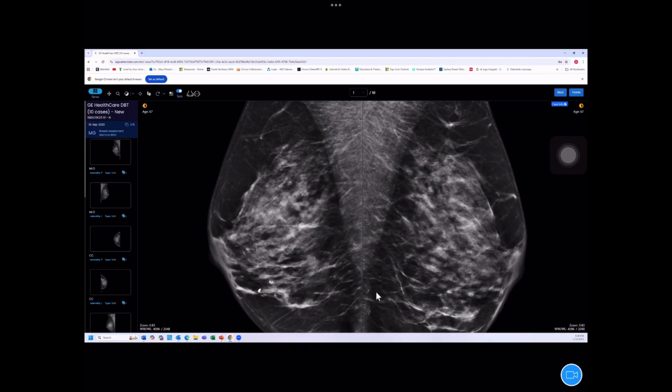And clearly down here, this patient has these calcifications that our eye is drawn to. When we look at these in more detail, we can see a rather non-specific density adjacent to these calcifications, compared to the other side, where we have a more normal space, fatty spaces between the tissues. So this is quite an obvious asymmetric density.